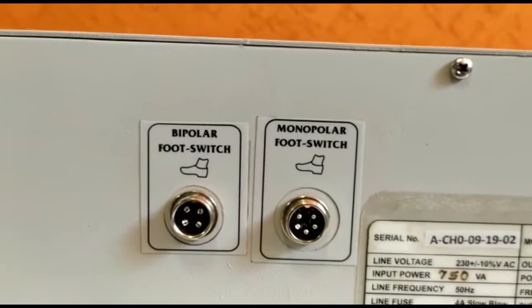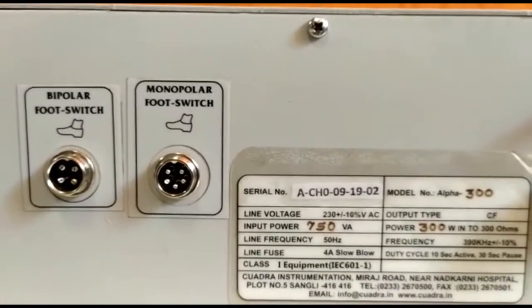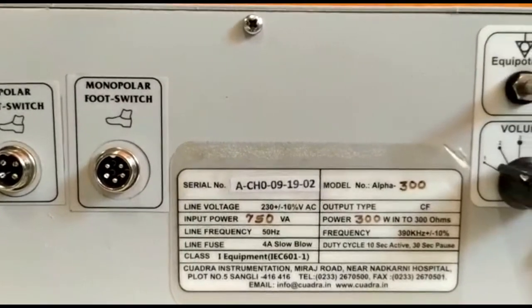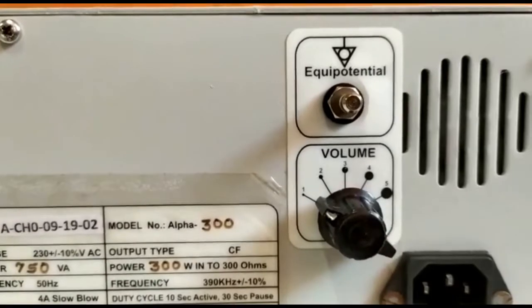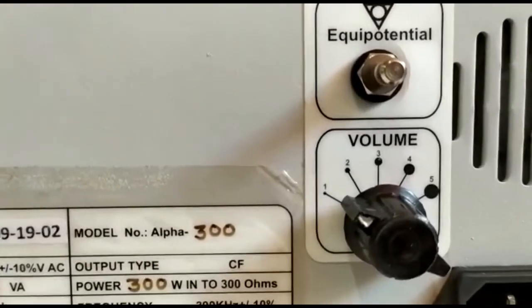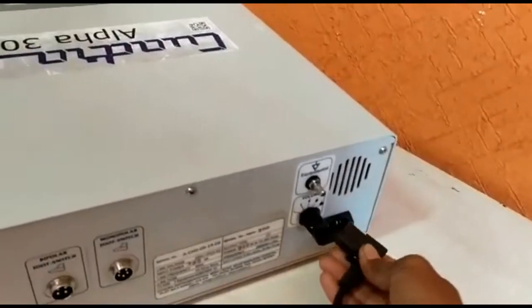The back side of the machine has sockets for the monopolar and bipolar footswitch. There is an equipotential terminal for connecting the ground, a volume control ranging from level 1 to level 5, and a power socket.